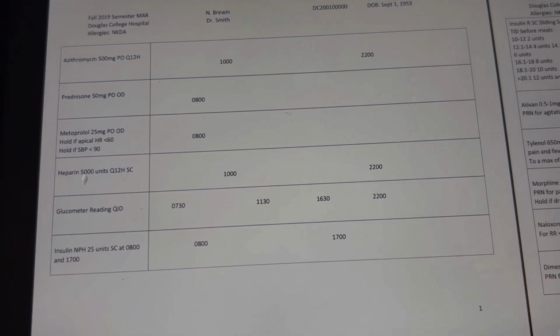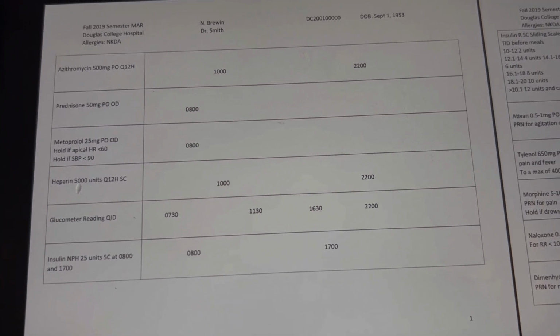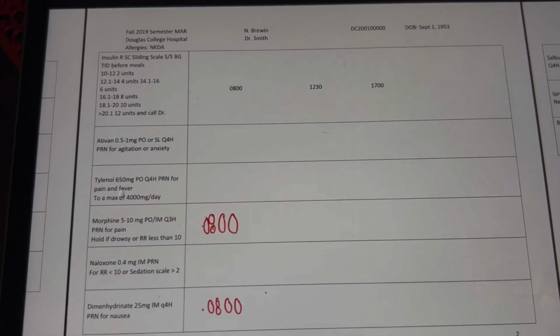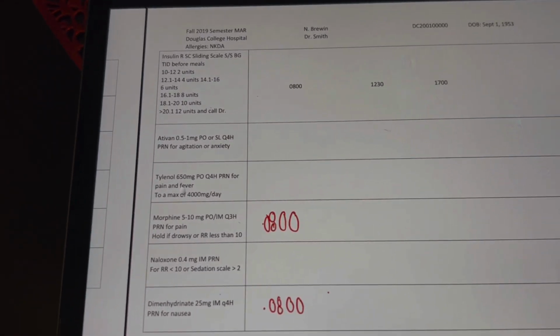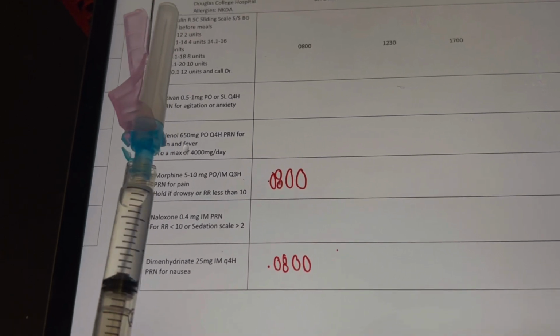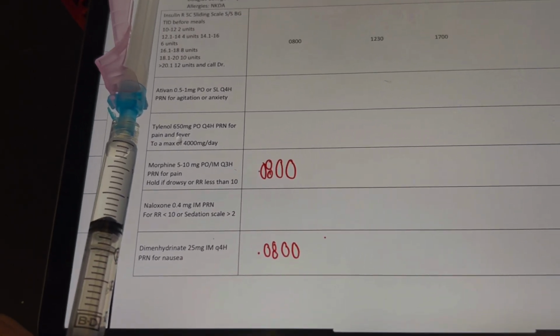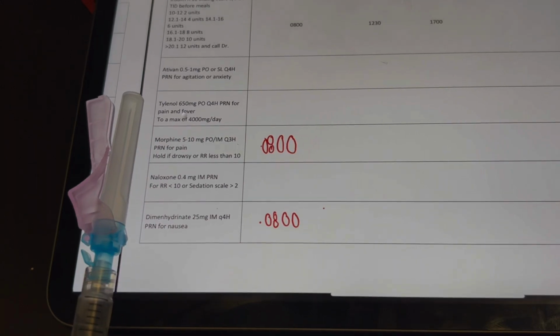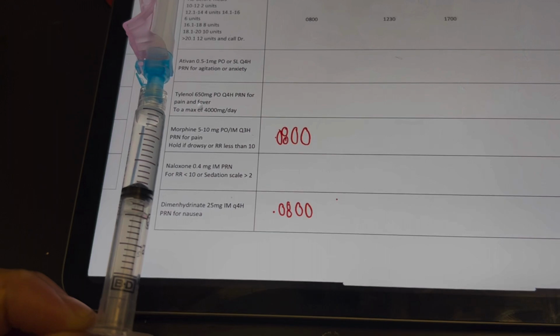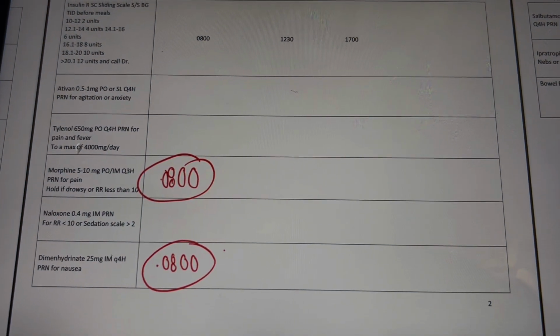I'm now gonna be doing my third and final check before I administer my medications to Natalie this morning. So we're not doing any medications on this first page, so we'll move on. First drug we have is gonna be morphine. So I have pulled 1 milliliter of morphine into the syringe. It is the right drug and is the right amount, and it's the right time. And then next I have Gravol. I have the right drug. I have 0.5 mils of this drug in my syringe currently. It's with an IM injection needle, and it's the right time as well. My third check is now complete.